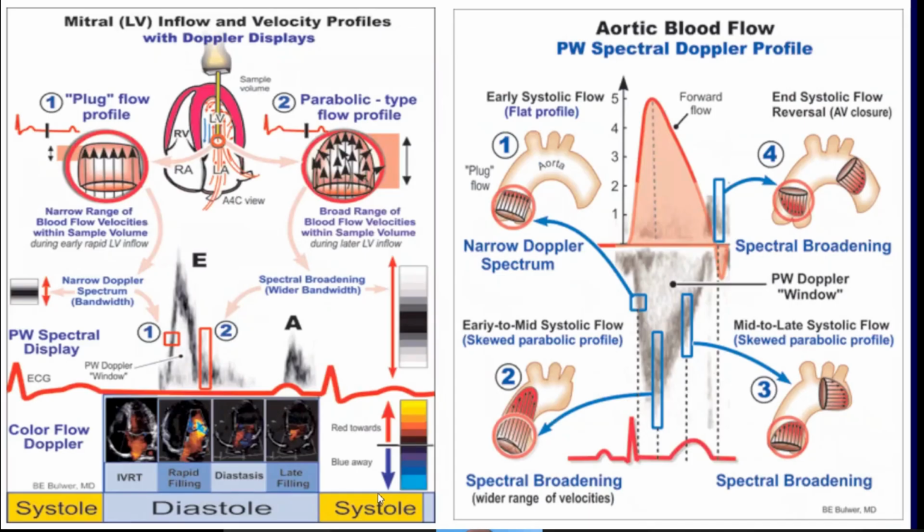Coming to the use of this in clinical settings, for example, this is an apical 4-chamber view using transthoracic echocardiography. You have put the probe at the apex, which is at the fifth intercostal space, just a little away from the mid-clavicular line.